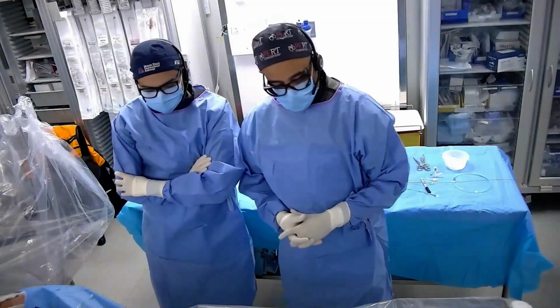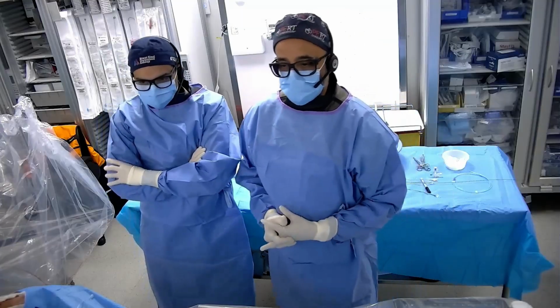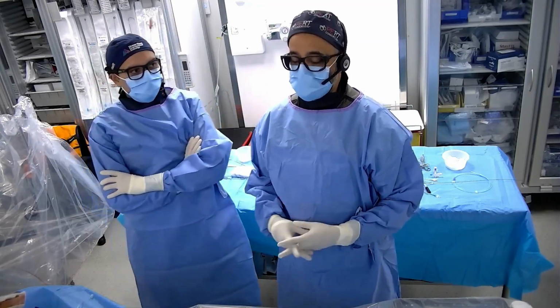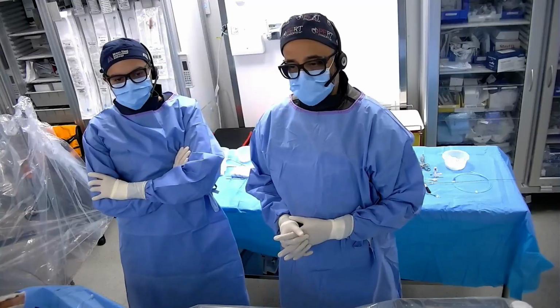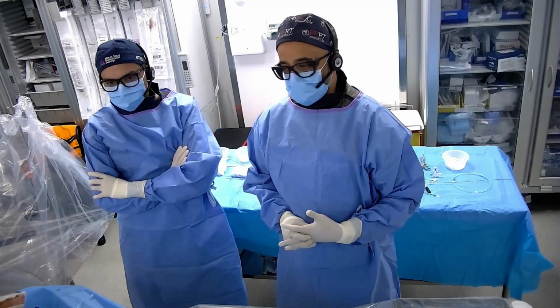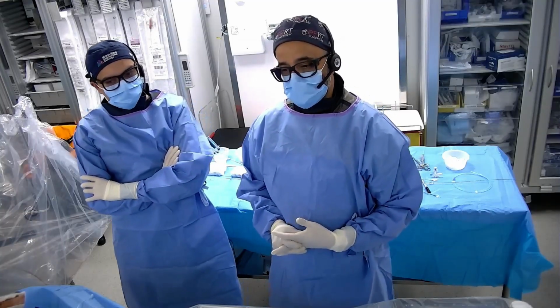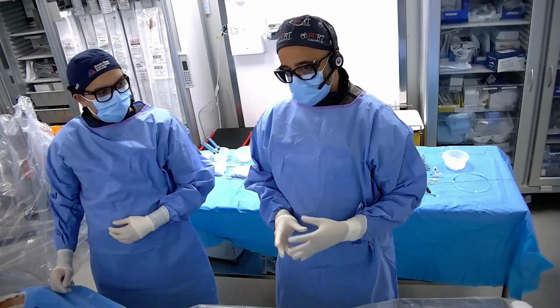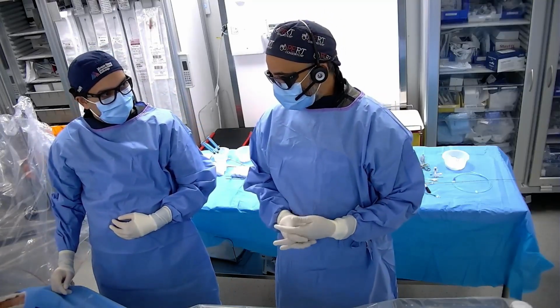So, Goegy, you do a lot of EVAR. It was originally a Gore device. It's something that we see. I think EVARs are, in essence, kind of like a Band-Aid, right? They basically seal, but the process that leads to aneurysms is still going on in the vessel wall. So sometimes we see this degeneration of the neck or even the distal seal. You do a lot of these. Do you see this frequently?